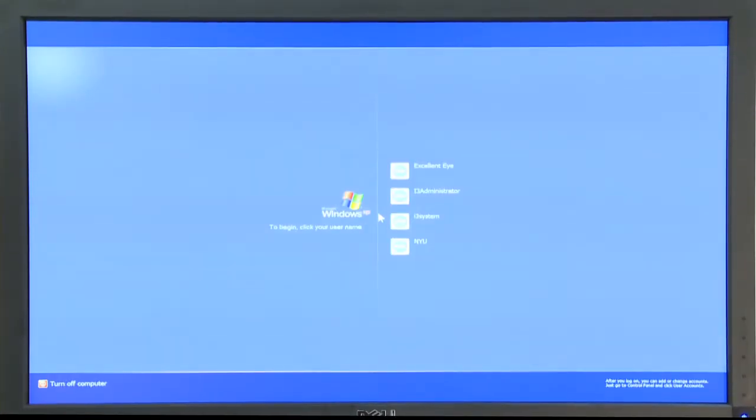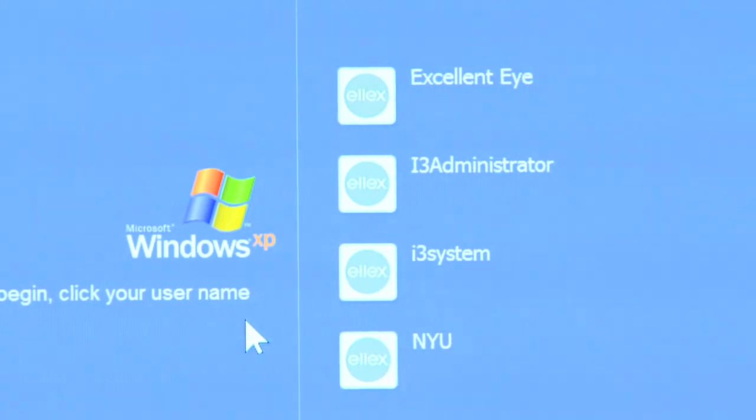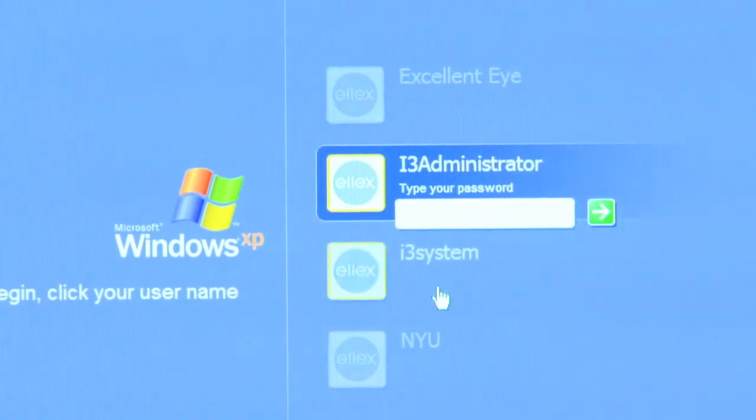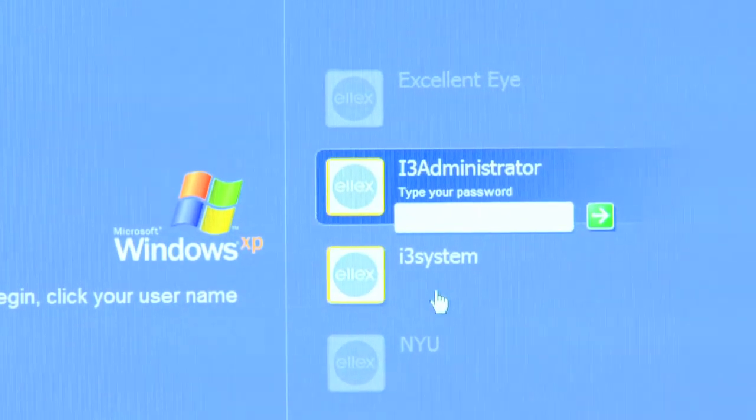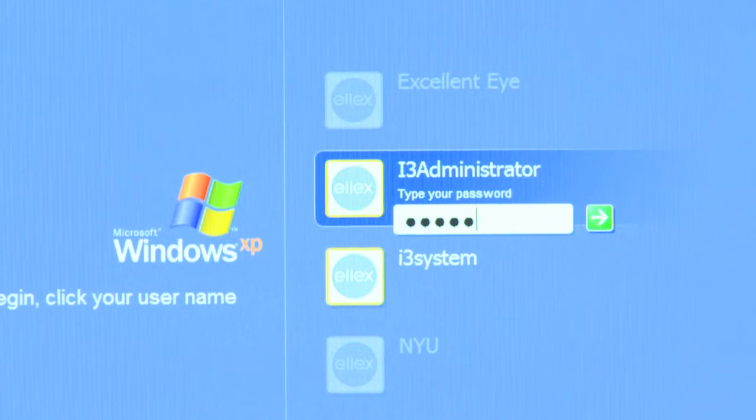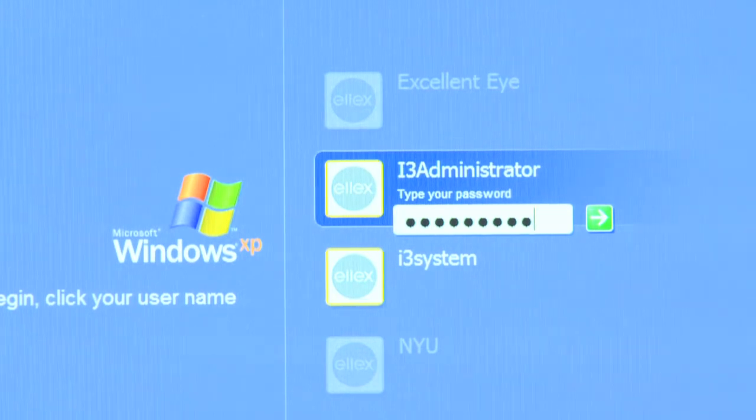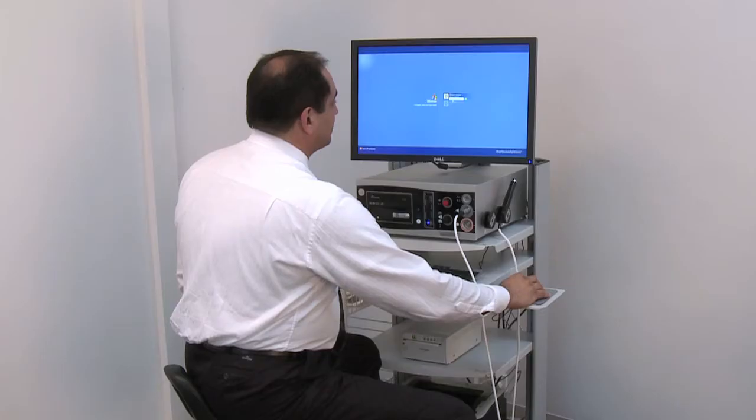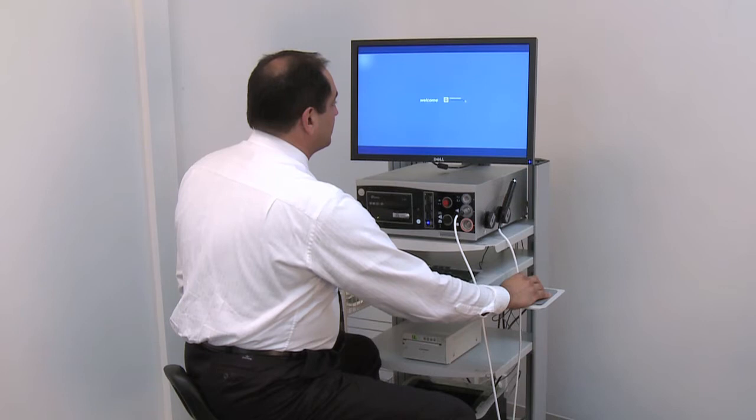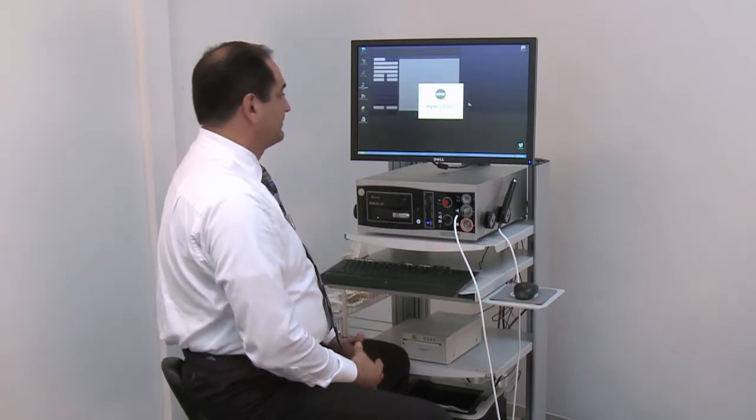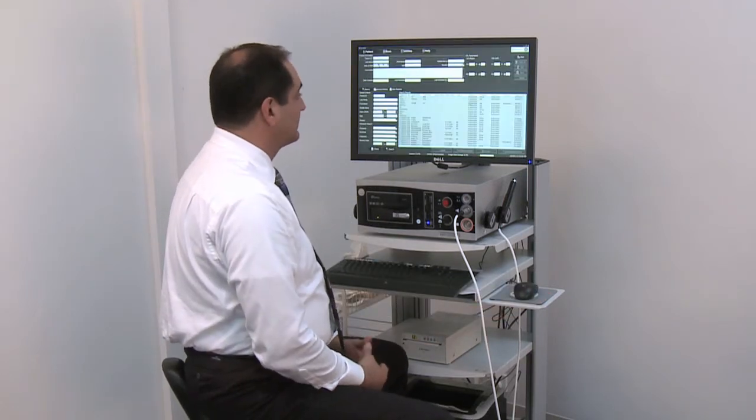Connect to the iCubed using the administrator user account using the default password. Click on the green arrow. You have now entered the iCubed software interface.